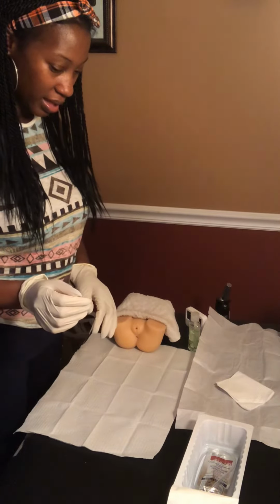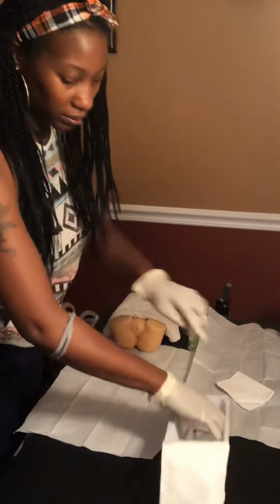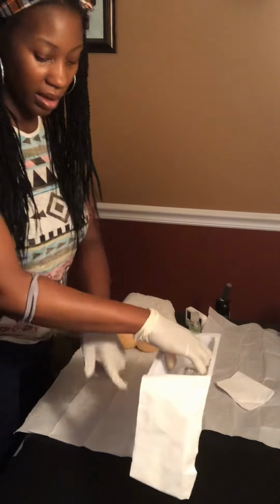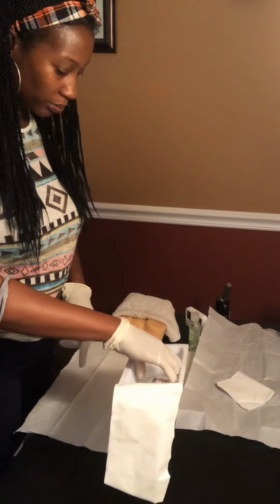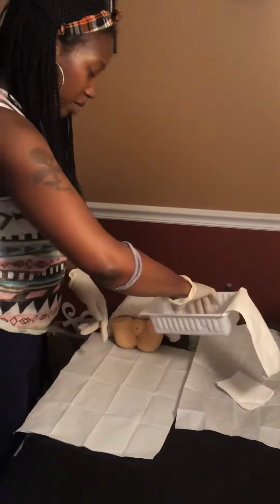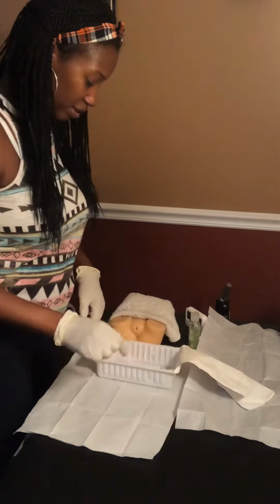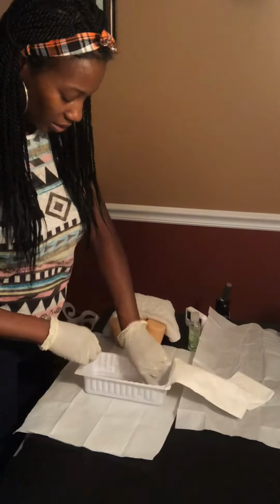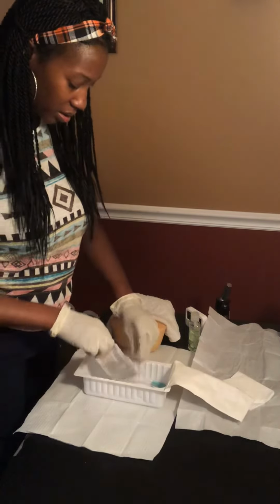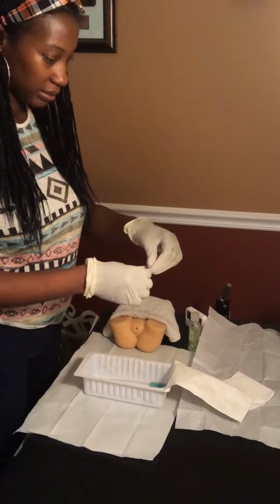So now that I've done that, I would take this whole thing off because the outer portion is contaminated. So I'm just going to turn this way so that's not on my sterile field. So I'm going to open up my iodine.